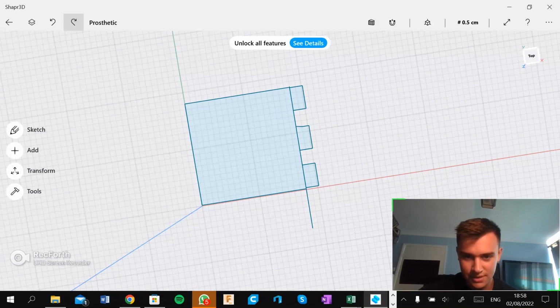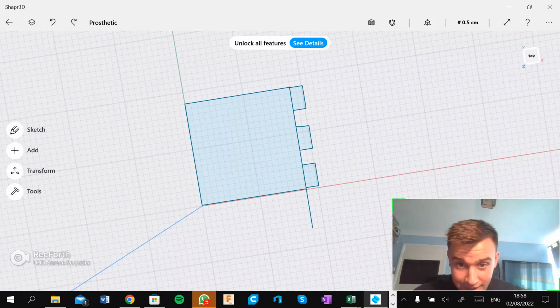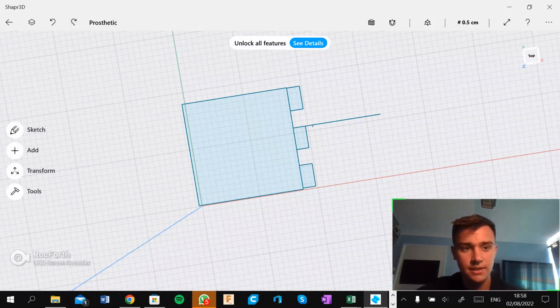Okay, and yeah, let's just skip through some of this quickly. And once again, you can see where the lines went there, around there. Yeah, that was just painful to rectify. And there we go. So now I'm working out the initial length of what I would like the finger to be. And let's do this.